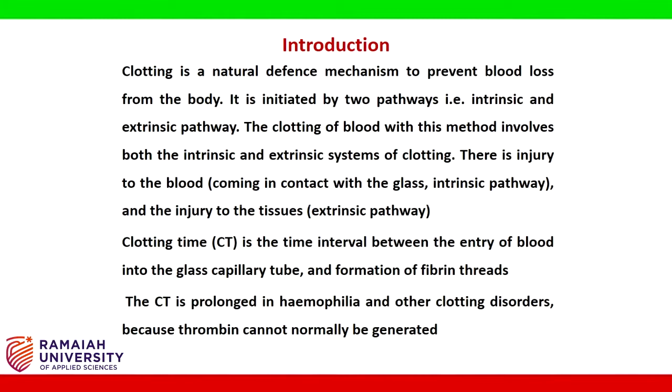The clotting of blood with this method involves both the intrinsic and extrinsic systems of clotting. There is injury to the blood which is coming into contact with the glass, which leads to the intrinsic pathway, and the injury to the tissues, which is the extrinsic pathway. Clotting time is the time interval between the entry of the blood into the glass capillary tube and formation of fibrin threads. The clotting time is prolonged in hemophilia and other clotting disorders because thrombin cannot normally be generated.